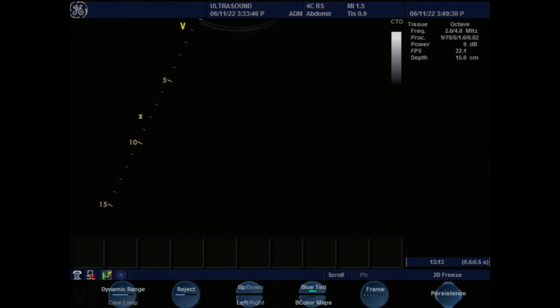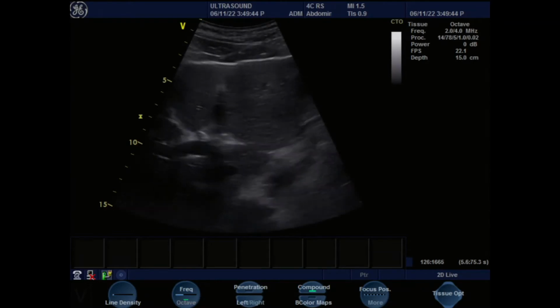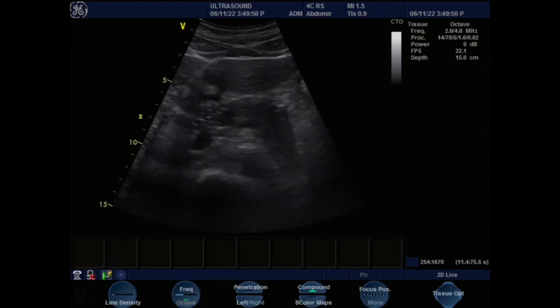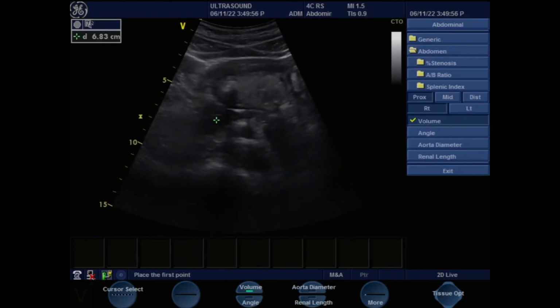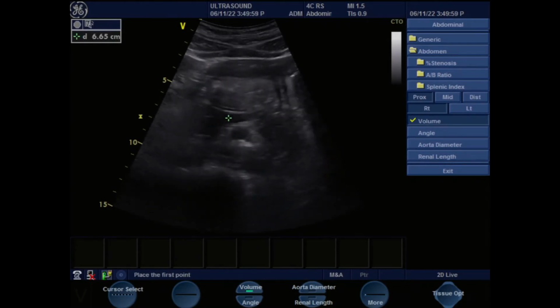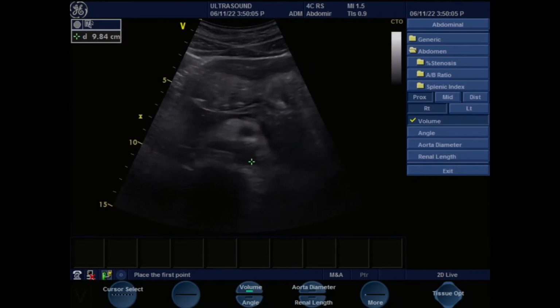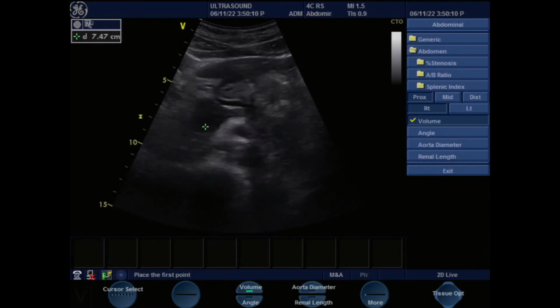All right, hold your breath, ready? Sorry. So we'll start with the pancreas, a little blob of jelly on the epigastrium, and then we have the gain here. Igor, can you help me with the settings here? So here is the pancreas. We see the landmarks here: aorta, SMA, pancreas here, splenic vein going into the portal confluence, IVC on the side here.